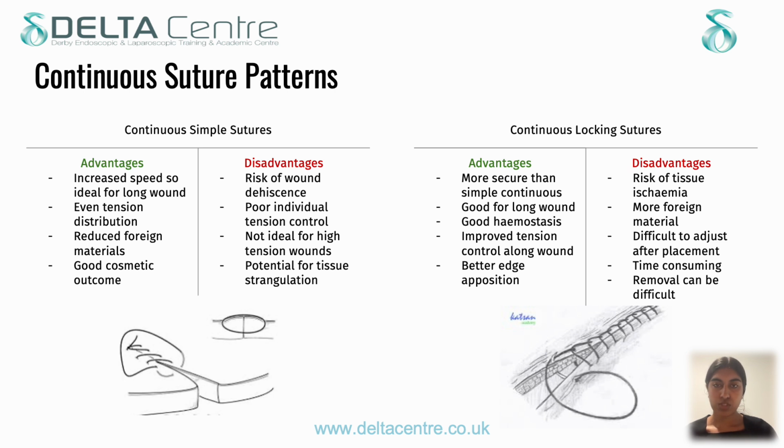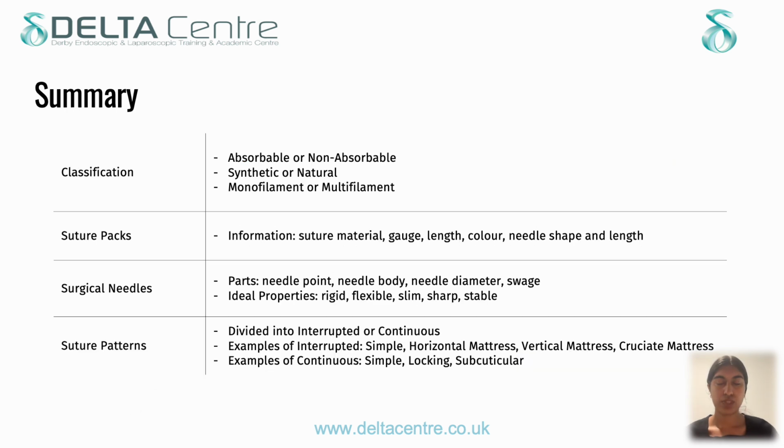And then it's difficult to adjust after placement, as once locked, the tension adjustments are harder to make without removing or redoing parts of the sutures. It can be time consuming and a bit more difficult to remove. And finally, just a summary of what we've talked about.